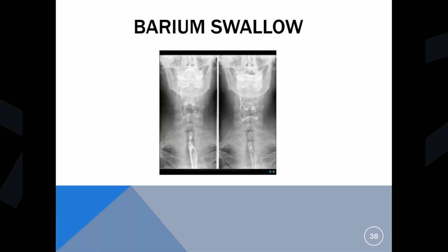And if there are any obstructions or issues with swallowing, then they can use therapy to help them swallow better. The risk is that if they don't do this procedure, the patient can have blockages, which can promote pneumonia. They'll have chronic pneumonia or other physical issues with being able to swallow and breathe.